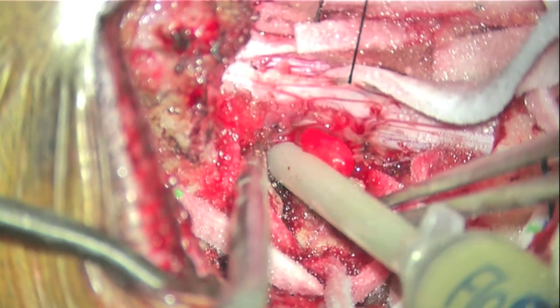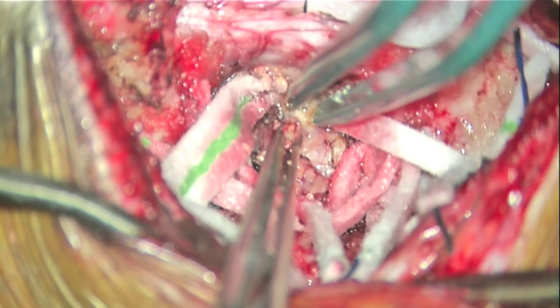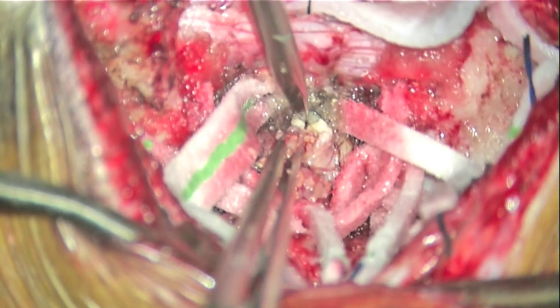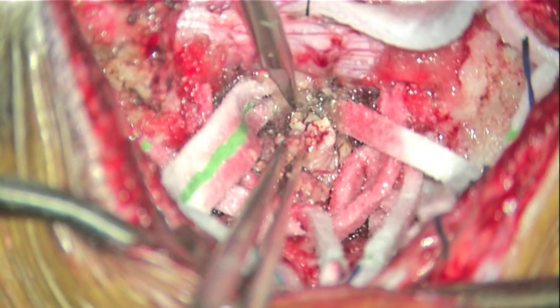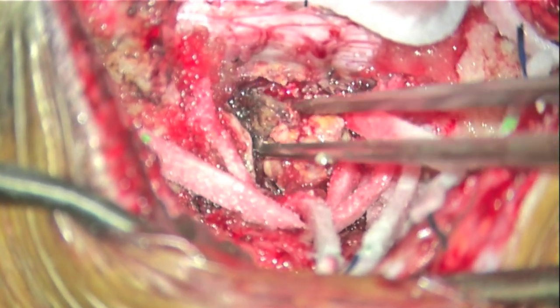Brisk epidural bleeding is controlled with FlowSeal. Fibrous adhesions and feeding vessels are systematically identified, cauterized, and divided to allow dissection to progress on the tumor capsule. Gentle traction on the tumor capsule often facilitates the dissection.